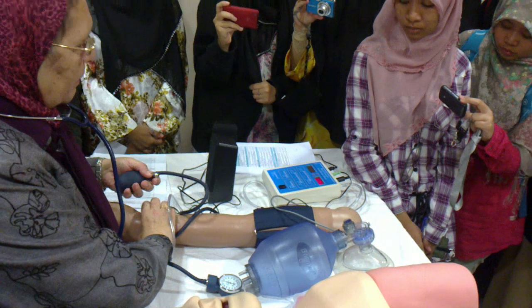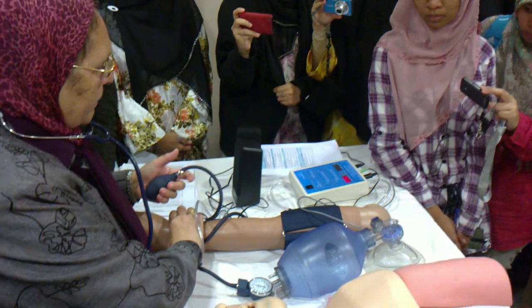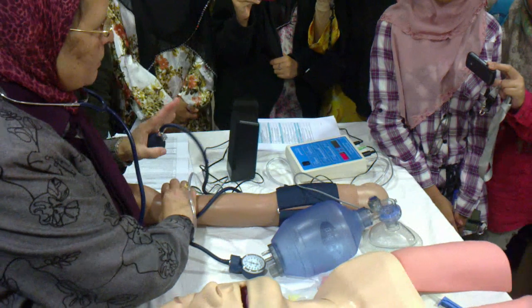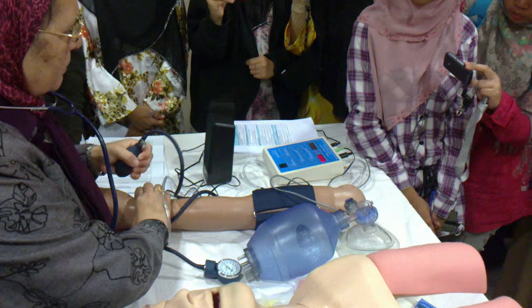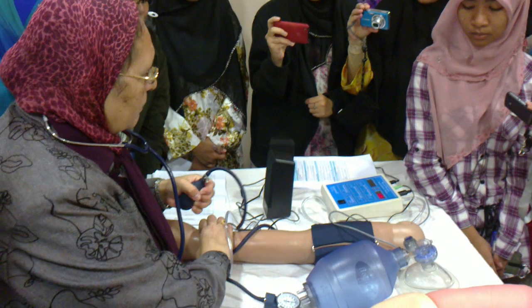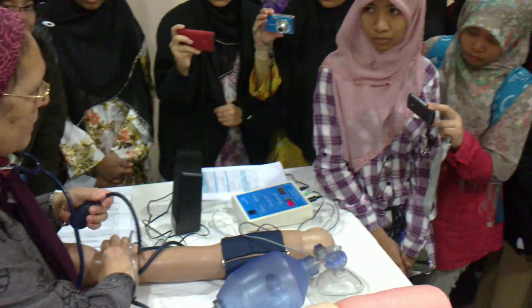I will repeat again. Okay, I feel it like this. You do the maneuver without speaking. Okay. The palpatory at 145. I feel it like this. I will elevate.